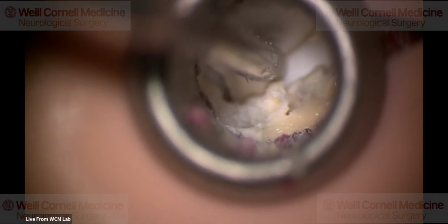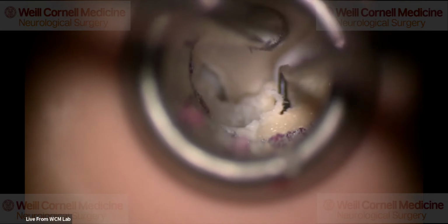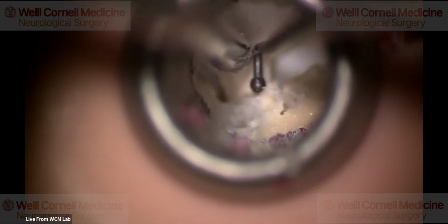But I also have Rosen instruments. Is that in focus for you guys? Yeah, good. So I think that this is here, that the SAP is here. So the nerve root is under the SAP. That's the IAP here, the inferior articulating process, and the SAP. So now the nerve root is being compressed.